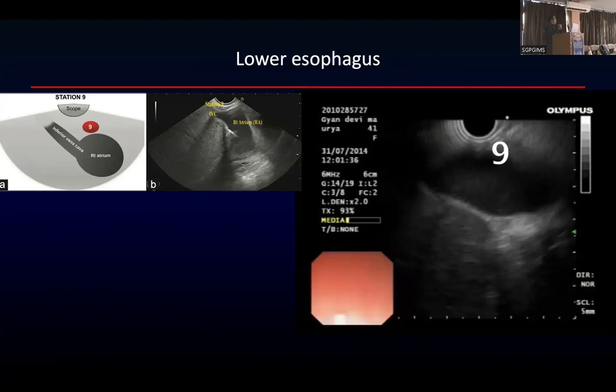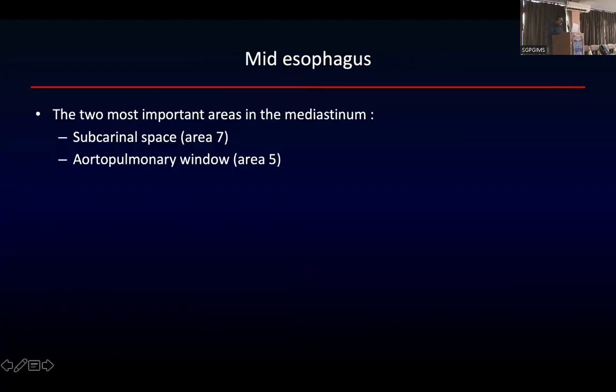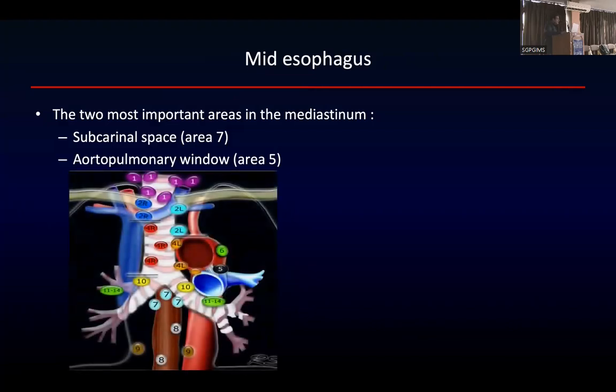Those are lower paraesophageal, that is station 8. Okay, that's the reason I'm saying it's important to understand and know the anatomy. Then the mid esophagus is the most important area, because here you have two important spaces that I'll talk of. One is the subcarinal space, another is the AP window.